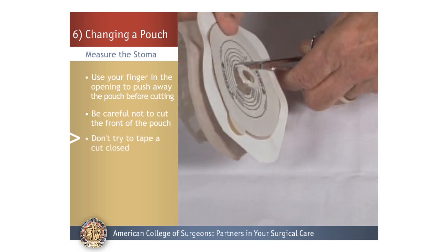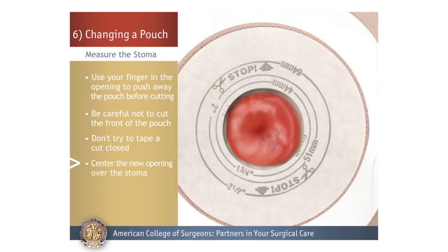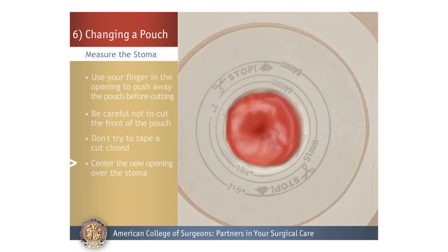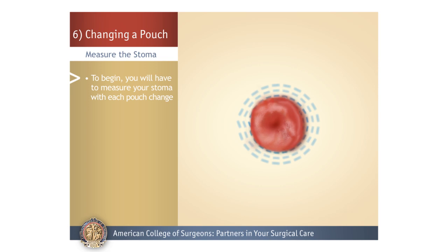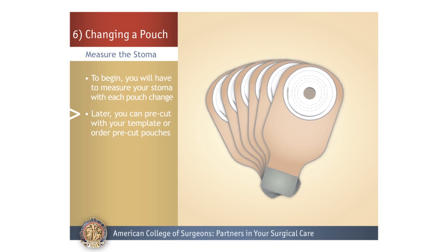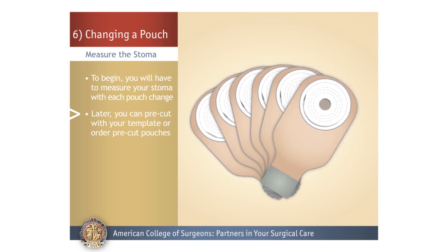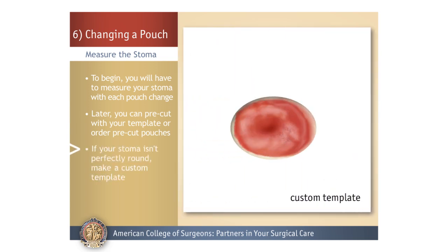If you do cut the pouch, do not try to tape it closed — it will leak and also emit odor. Center the new opening over the stoma to make sure it fits along the stoma edge. For the first several months, your stoma will continue to shrink in size as swelling goes down, so in the beginning you will have to measure your stoma with each pouch change. After that, you will be able to pre-cut your pouch opening from your template or order pre-cut pouches. The opening should fit very close to the edge of the stoma to prevent skin irritation. If your stoma isn't perfectly round, work with your ostomy nurse or doctor to make a custom template.